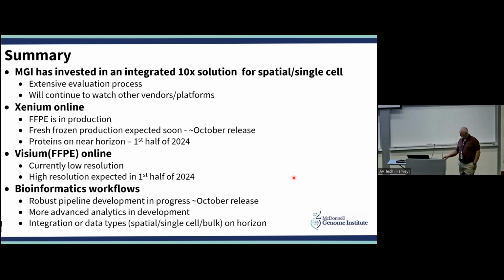If it's something you're comfortable doing, and you've got a relatively small section, it's going to fit in there, no problem. If you're comfortable making the sections and putting them on slides for microscope work or whatever, it might be just fine. But if you don't have that ability within the lab, especially working here, make sure you're in the neutral zone of the slide, because if you get outside of that, it creates all kinds of problems.